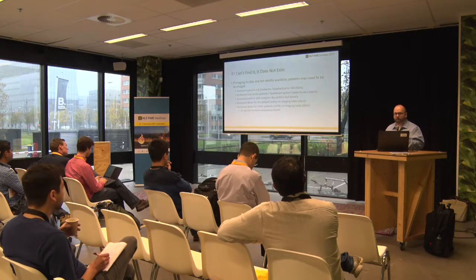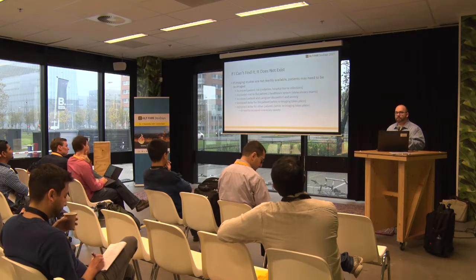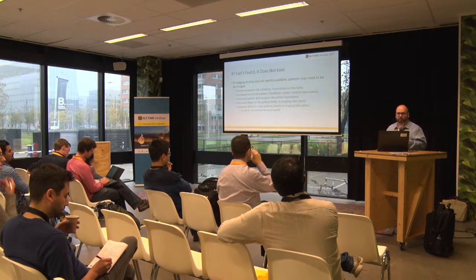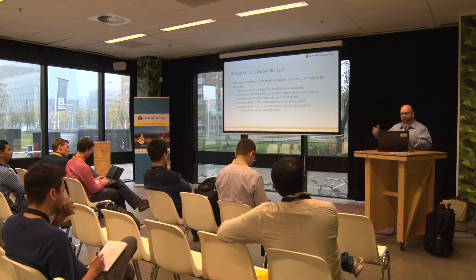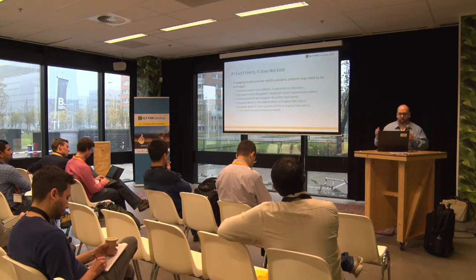An old Google mantra is, if I can't find it, it doesn't exist. And that's really bad in imaging, because it means that we might have to re-image the patient. When we do that, we expose them potentially to more radiation, as well as the possibility of hospital-borne infections, and increased costs to the patient and the healthcare system by having additional unnecessary exams. It increases the discomfort if they have to do contrast or injections, as well as anxiety for maybe the patient's spouse and family, and delay for the patient because we have to re-image the patient, and possibly delay for other patients as we back up the healthcare system. Or we might need additional capacity just to handle these cases.